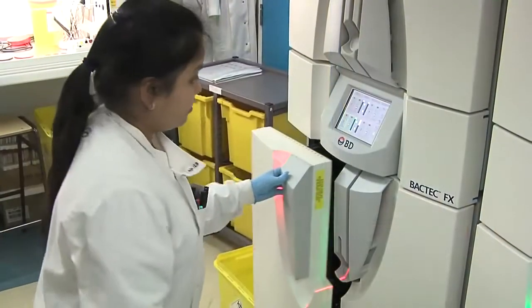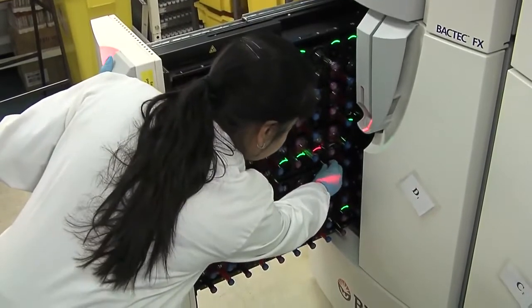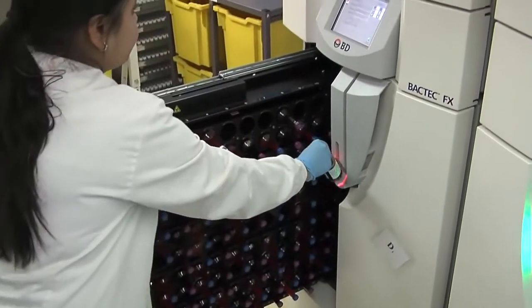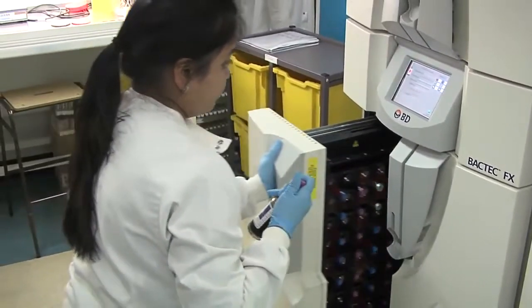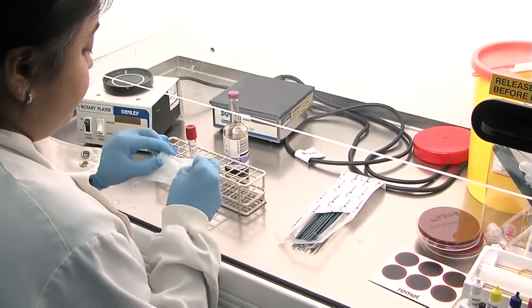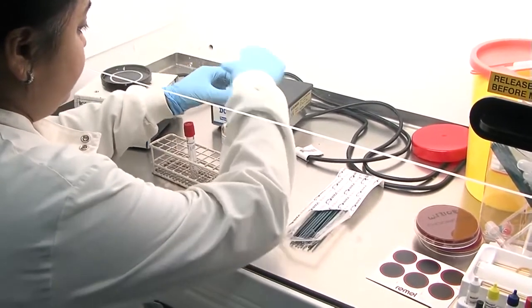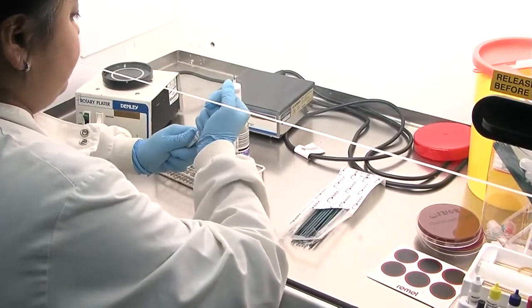Once the fluorescence reaches a specific threshold, the positive indicator light flags on the machine and the biomedical scientist needs to remove the bottle to find out what is potentially causing the bloodstream infection. We cannot predict what might be present in a patient's blood culture, and therefore, in this setting, all manipulations of positive blood cultures need to take place in special containment equipment to protect the lab staff, and in this case, a Class 1 safety cabinet is used.